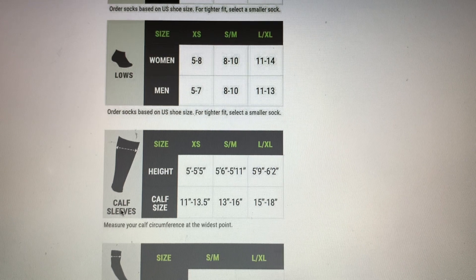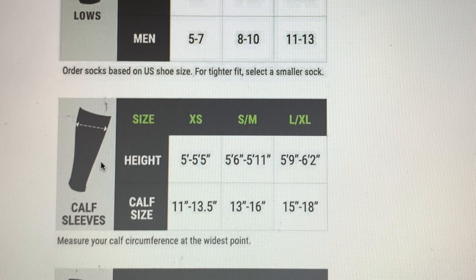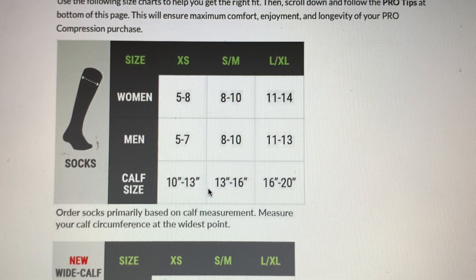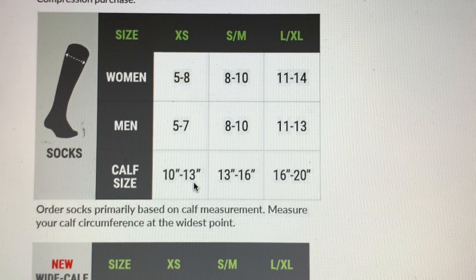For mid-calf compression socks, they only go based on shoe size. These are the calf sleeves — they have no foot — and these are the ones you do not want to wear for long travel to prevent swelling or blood clots. Whatever brand you're interested in, make sure you check out their own individual sizing charts because they vary from brand to brand. Also, the calf size overlaps between sizes, so brands typically recommend sizing up if your calf size falls on the border, rather than sizing down, unless you want that tighter compression.